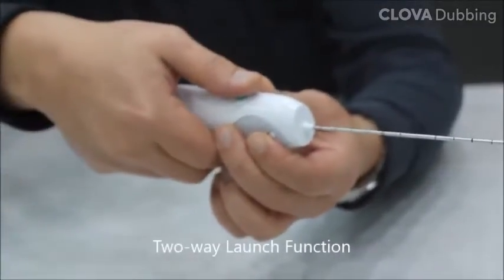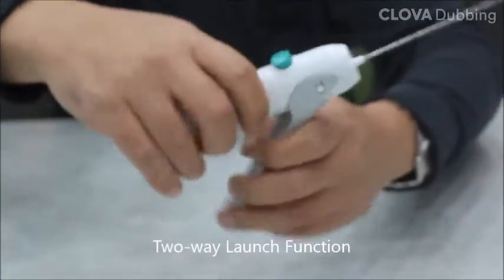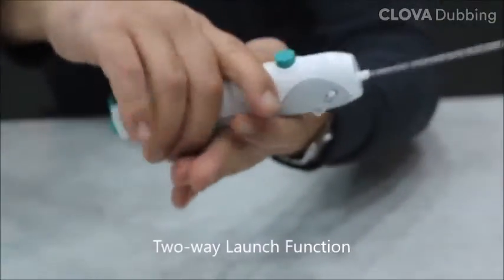S-Biopsy comes with two different launch functions. The launch method can be chosen according to the user's purpose of use and convenience.